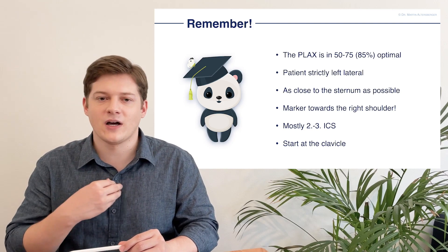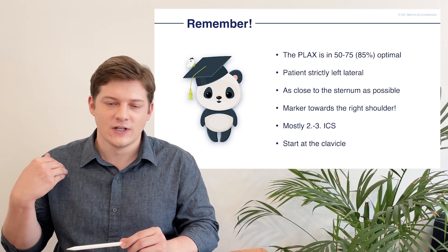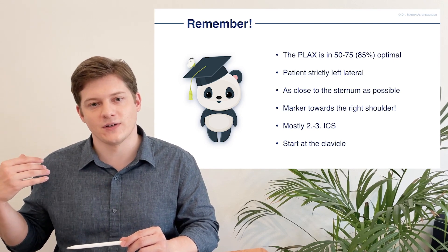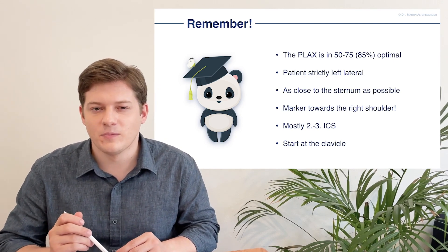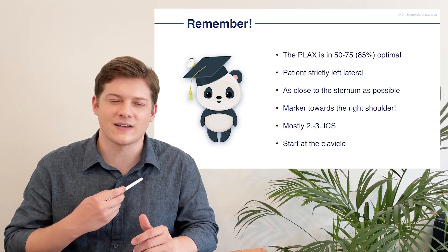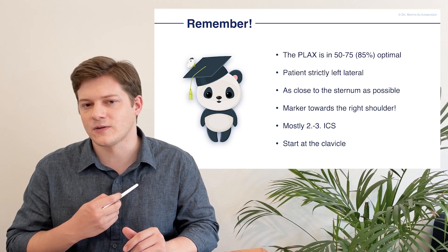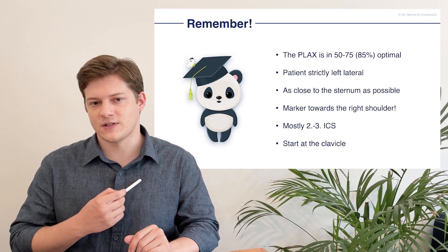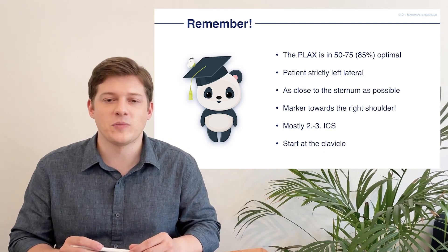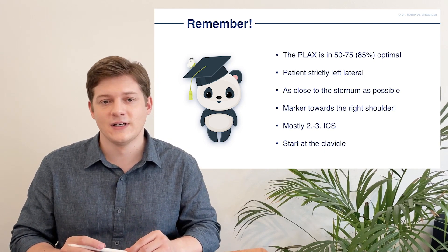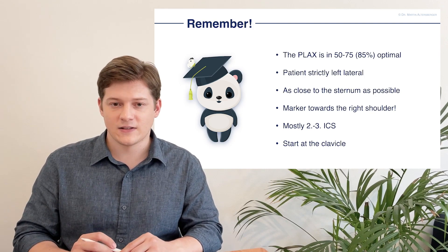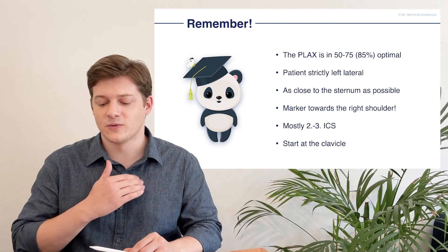The marker always points to the right shoulder — don't point it cranially, don't point it to the lateral side, really to the right shoulder. Mostly the view you want to acquire is located between the second to probably the third intercostal space. Don't be discouraged if it's sometimes in the fifth or even sixth intercostal space — that can simply happen and is very different among patients. Once more, start really at the clavicle; if you do that the parasternal view is relatively easy to acquire.